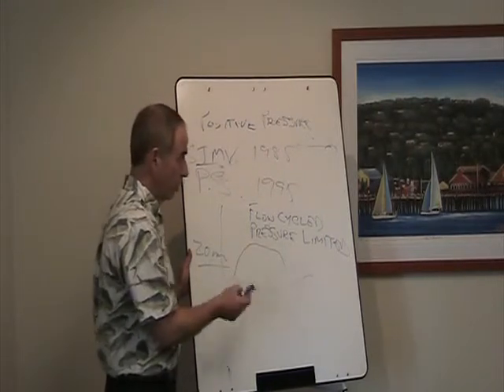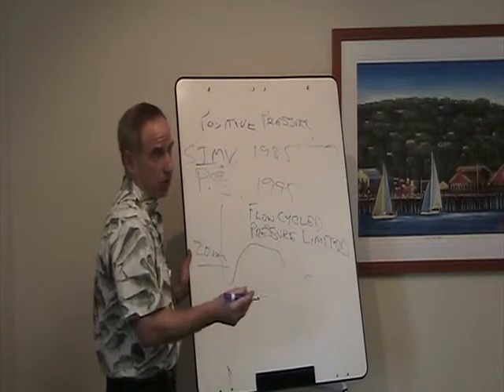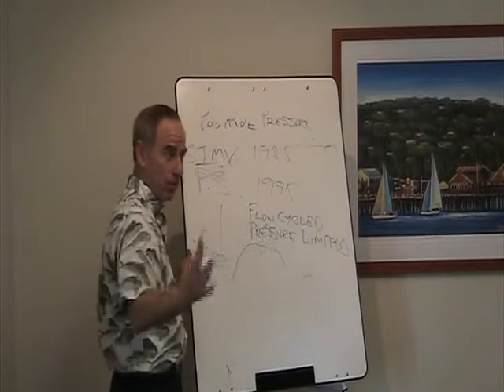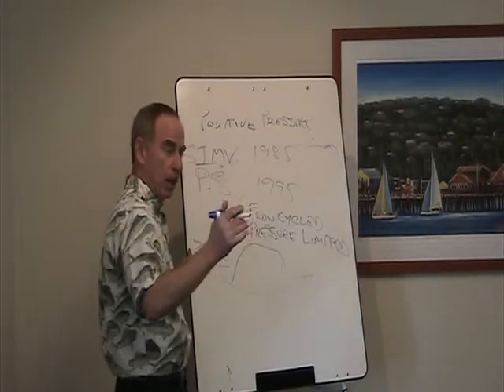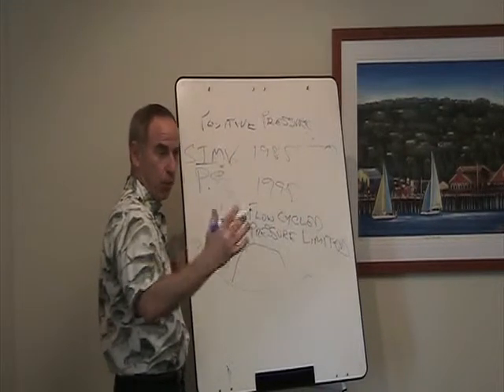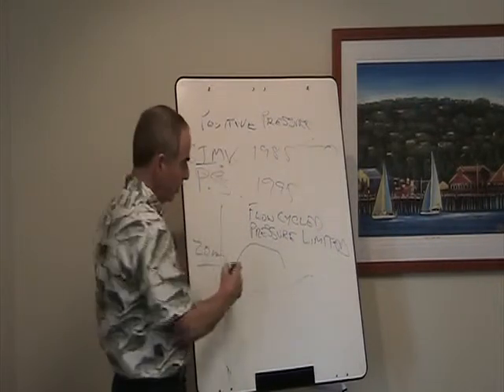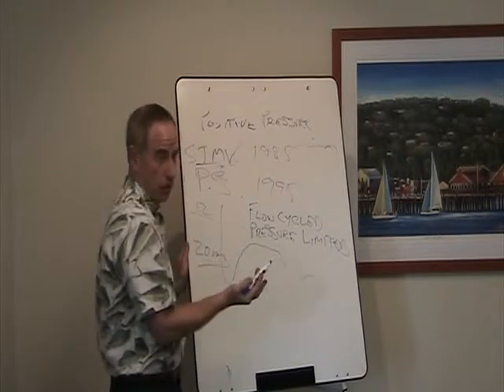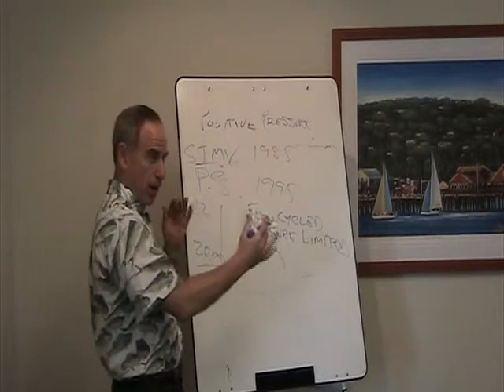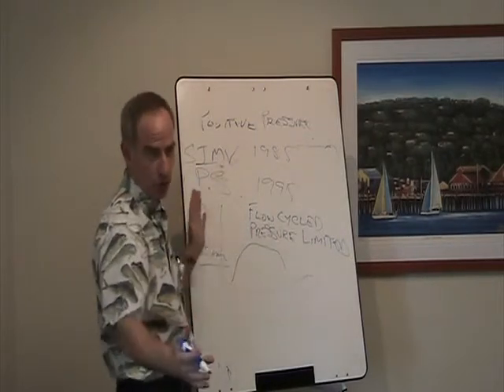So why was this developed as a mode of weaning? Because pressure support, the idea behind it was, as opposed to assist control with the T-piece trials where the patients were doing all the work or none of the work, depending on whether they're on the T-piece or not, right? In IMV, as you go down on the rate that you set, the patient's doing all the work in between those set breaths, or they're doing none of the work during the set breaths. So if I set it at 12 times a minute, they're doing no work. Whatever they're breathing on top of that, they're doing all the work. So it's all or none. But it's breath to breath, whereas with assist control and T-piece, you're just putting them on for an extended period. They're doing all the work or none of the work.